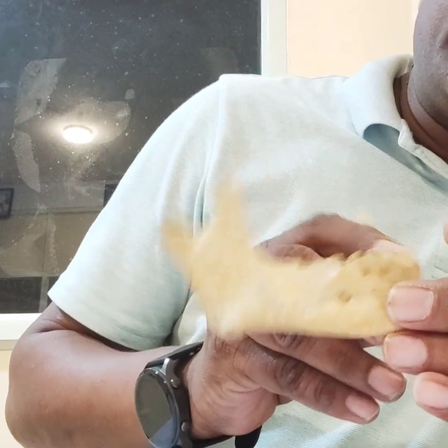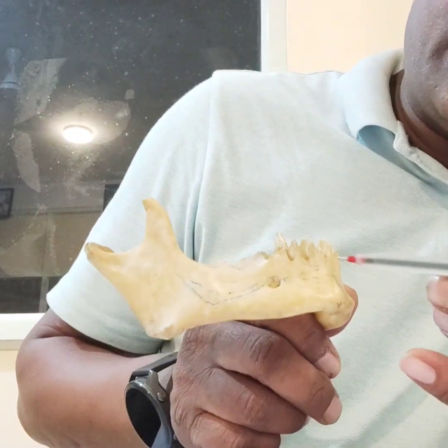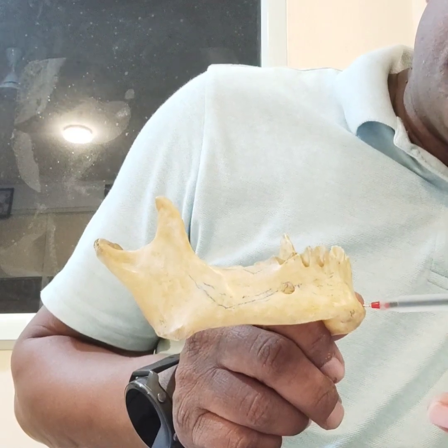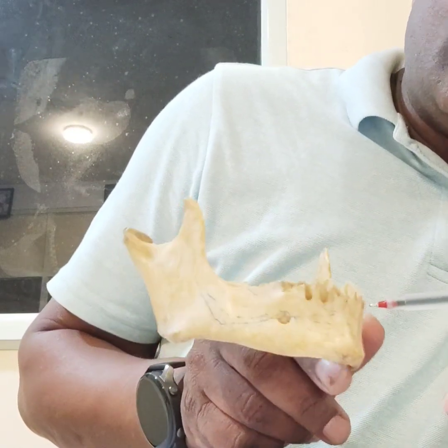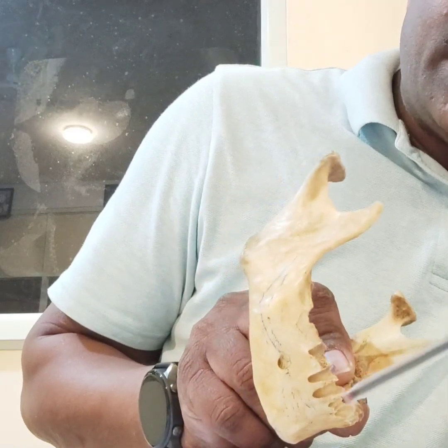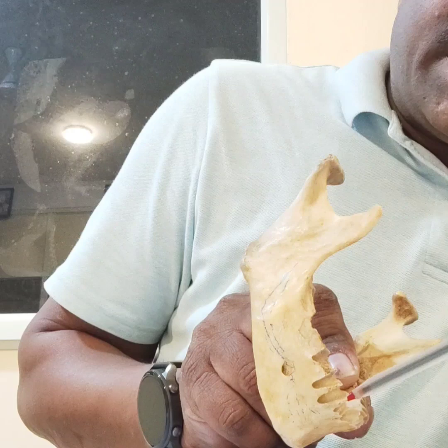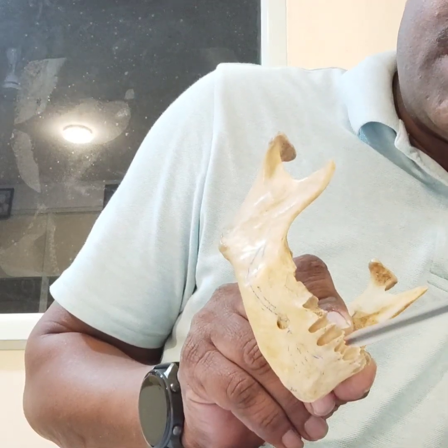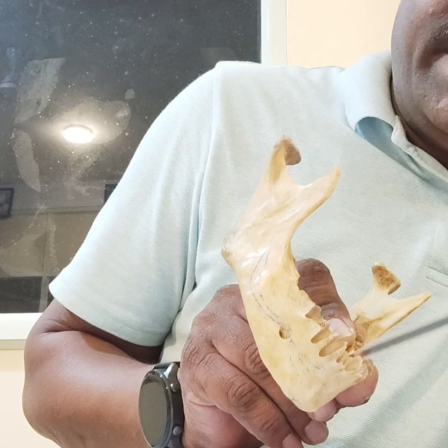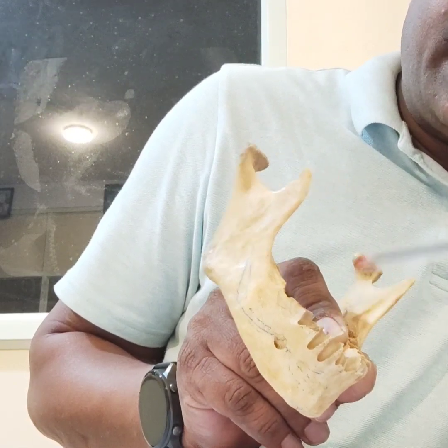While engaging the implant in the anterior mandible, it's very easy. There won't be any important anatomical structures. You can engage till the base of the mandible. You can engage up to 20 mm or 21 mm. The only thing is you should not perforate the lingual aspect of this mandible, where there will be a lingual plexus of arteries, small capillaries. If you perforate the lingual plate, there will be anastomosis. These arteries will bleed, and you may come across a hematoma in the floor of the mouth. That should be taken care of.